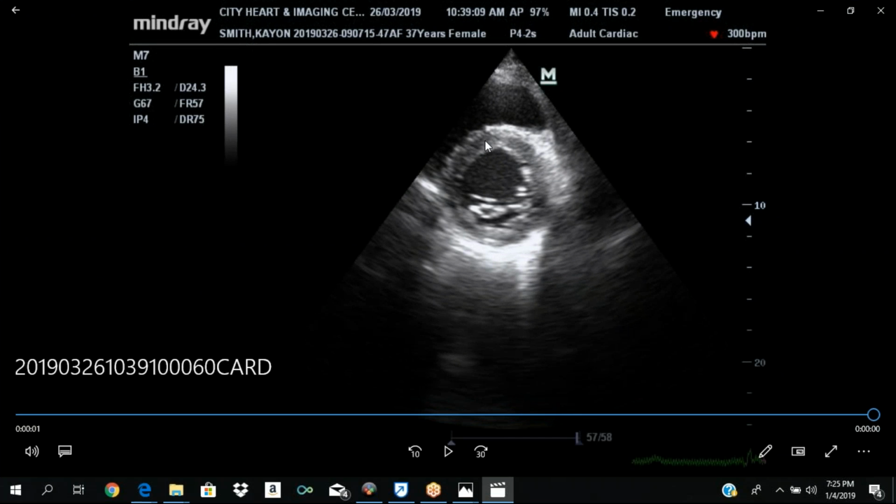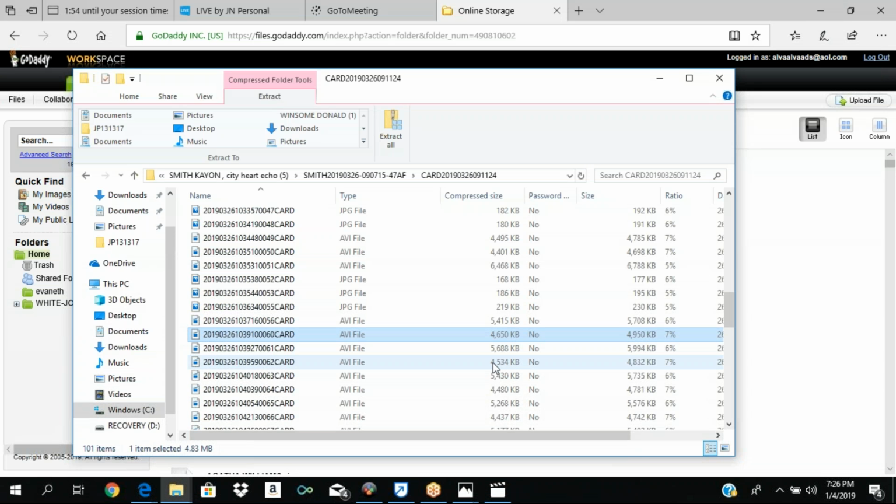This is our anterior wall up top. The inferior wall is down the bottom. This is your septum, and the lateral wall is over here. This is the right ventricle right up there. Okay? And the mitral valve is right inside here. The anterior leaflet is on top, posterior leaflet is on the bottom. So short axis at the base. And of course, as we said, we'll put color in everything.